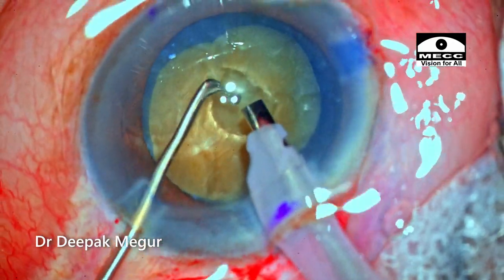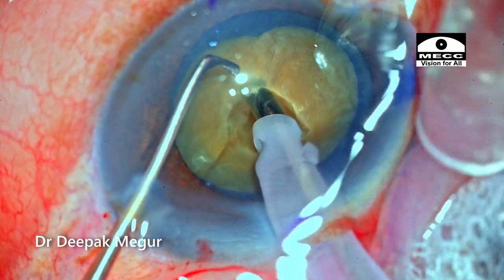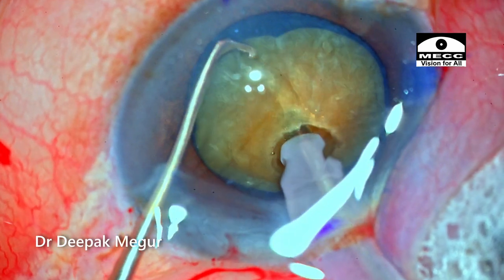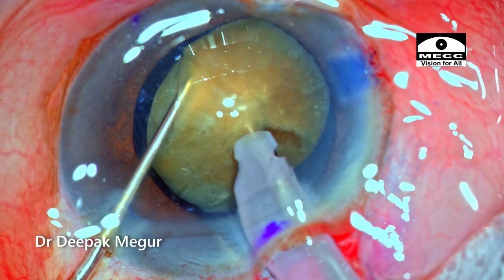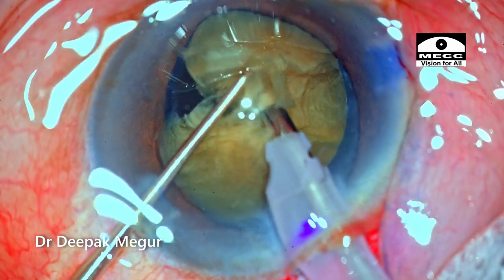The plan is to create a small initial trench followed by a horizontal chop. The initial trench of about 50 to 60% is created. Then the nucleus is held firmly with the phaco tip, buried into the core of the nucleus, and slightly lifted up so I am well away from the posterior capsule. The chopper goes in, hooks into the nucleus, and scores it. I suddenly have a jerky feeling when the posterior plate just gives away.